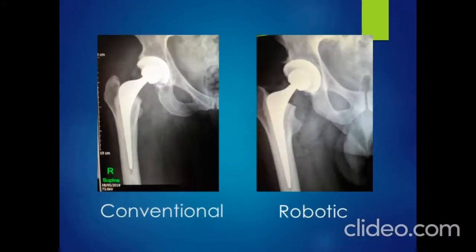And we've heard great talks again from Max and Winston about the positioning of implants and how that can be exactly right. It may only take a trained eye for me to tell you that on the left side, the cup isn't fully anteverted, so isn't facing forwards quite enough. In most patients, that won't matter, but in some patients it will. Maybe that's about the feel of the joint or an increased risk of dislocation.